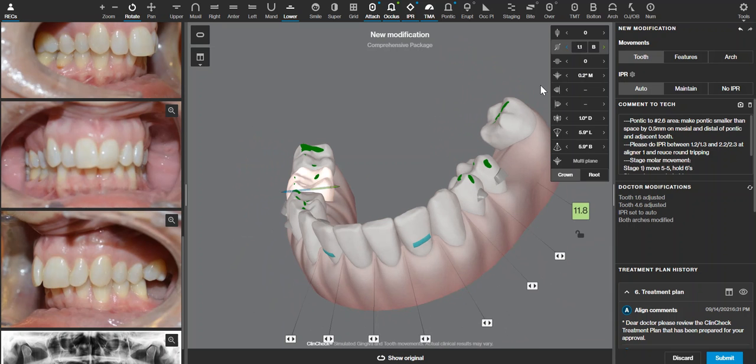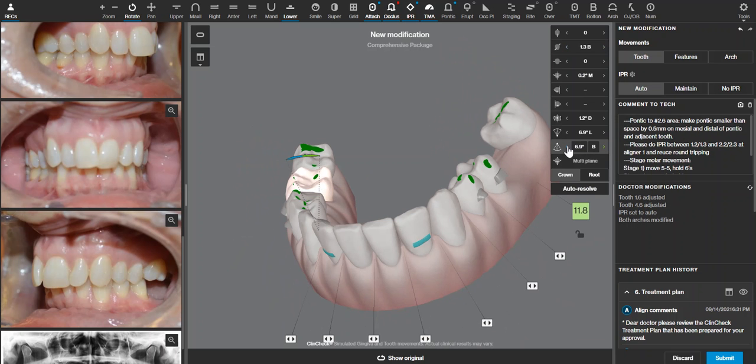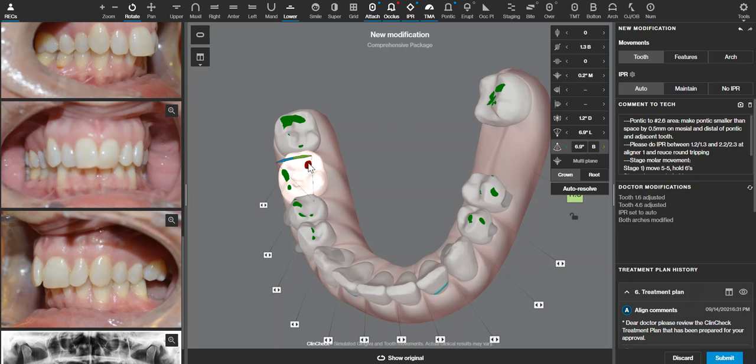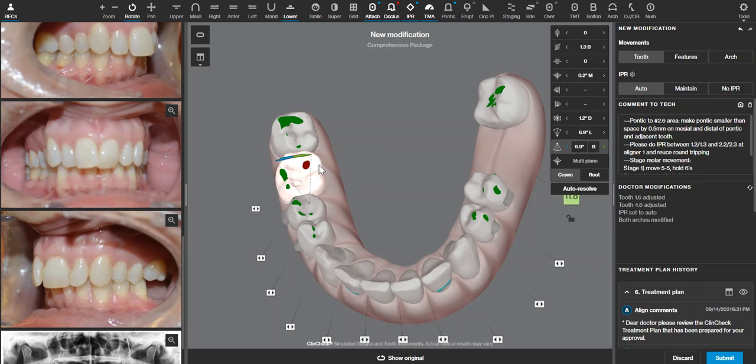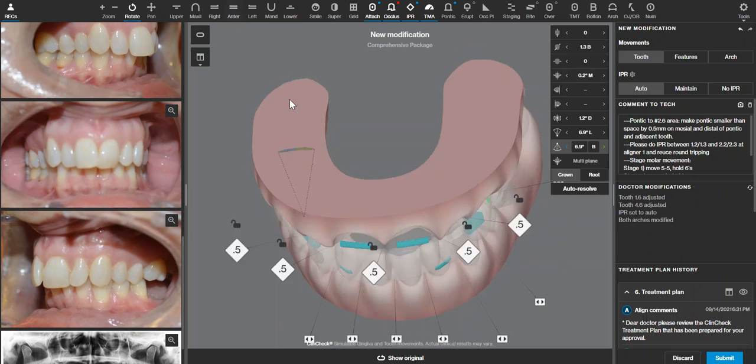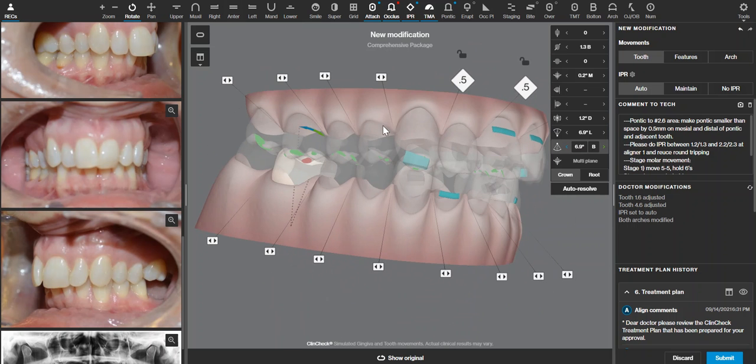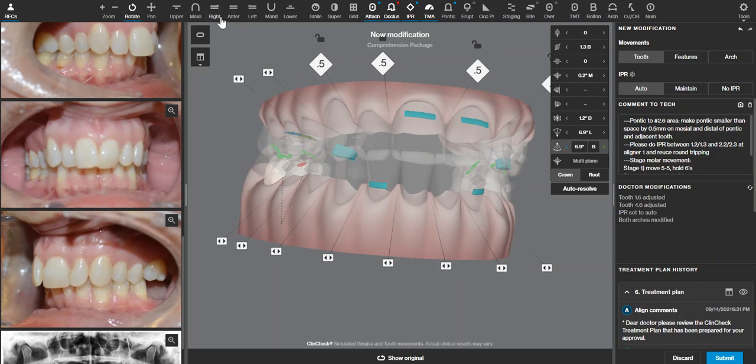that is not a really bad thing. I'm just going to tip that one more time and then if I can get just any little bit of heavier occlusal contact, I feel more comfortable that I'm not going to finish with a posterior open bite.